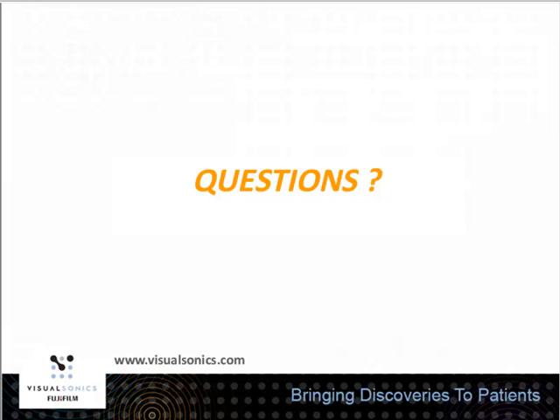Great question. I'd say we're in the validation phase of that. What we've been doing is taking standard agents like doxorubicin or others. And really what you can do is take your standard parasternal long axis or short axis image, and as long as you collect at high enough frame rate, you can do that analysis offline. That's the beauty of strain: the data is typically there, so if it's something you're interested in, you can go back and get it. We're really in the beginning stages of analyzing if some of those strain and strain rate parameters are indeed more sensitive.